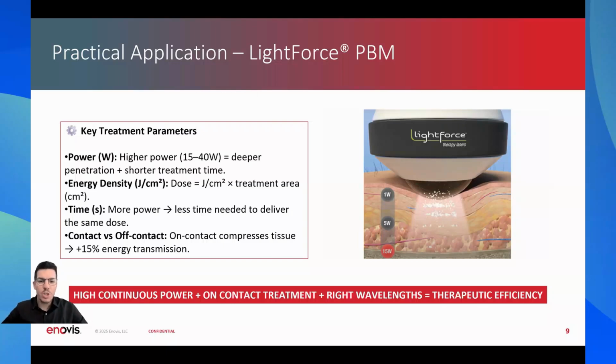What are the key parameters for a correct clinical application? Since for photobiomodulation to be effective, it will be essential to adjust the therapeutic parameters based on the injury, the recovery phase, and the patient's response. These are the pillars that allow the treatment to be adapted with clinical judgment, which is what we are going to present to you next.